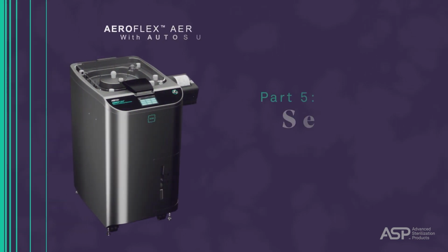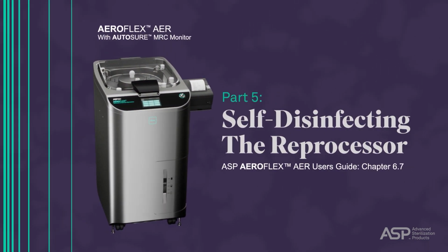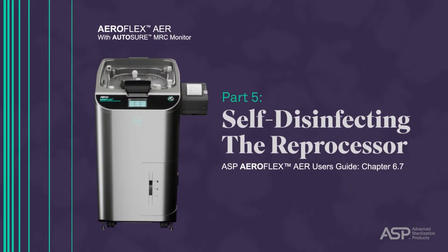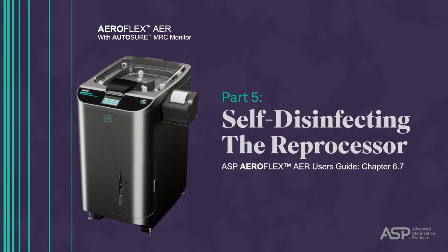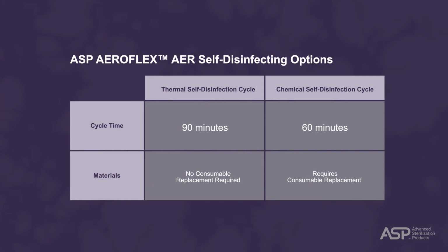The ASP AEROFLEX AER is designed to be self-disinfected once per week. It is important to run self-disinfection regularly to prevent buildup of biofilm. Depending on your facility's preference, you may select either thermal or chemical self-disinfection.